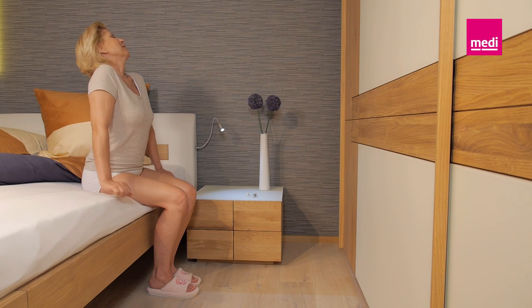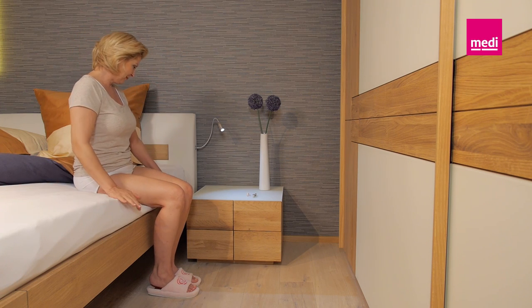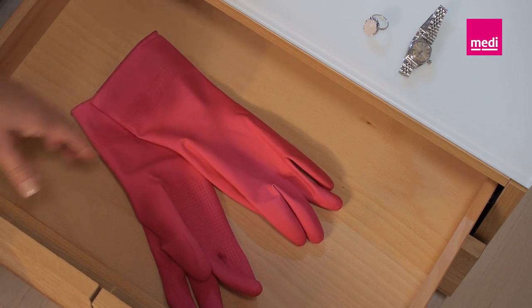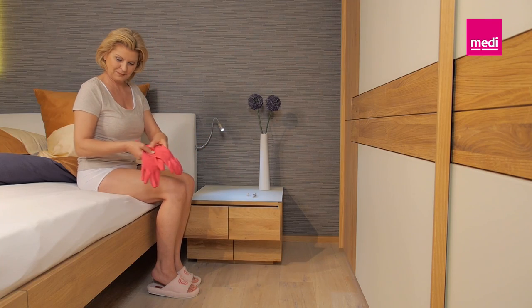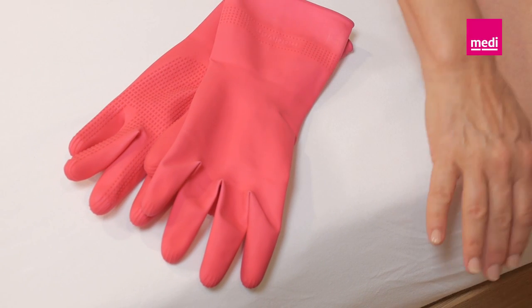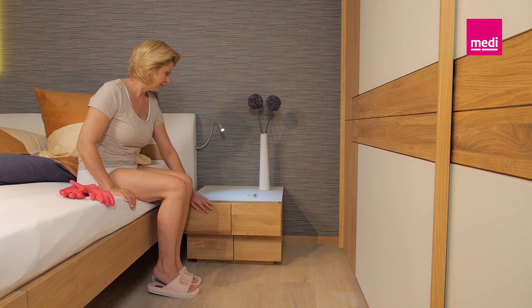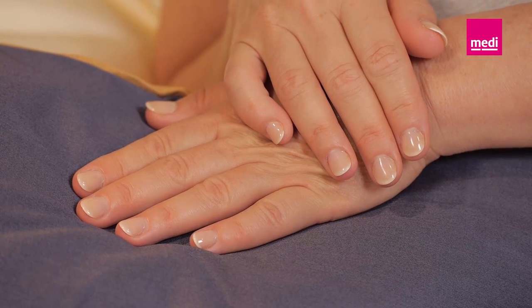It's best if you put on your stockings straight away after getting up in the morning. Please have your rubber gloves ready as well. You will use these later to smooth out the material over your leg, or you can put them on immediately and wear them while you are putting the stockings on. The rubber gloves adhere particularly well to the stockings and aid application. You can buy special gloves for this from medical retailers, for example from a surgical appliance shop.